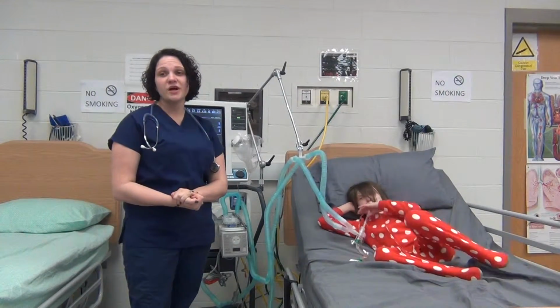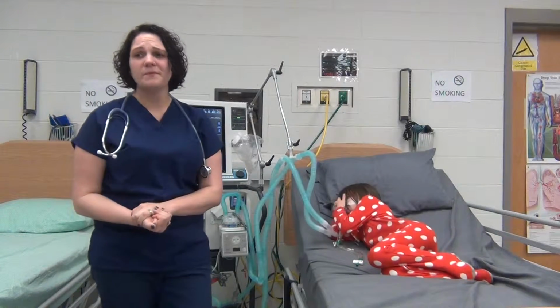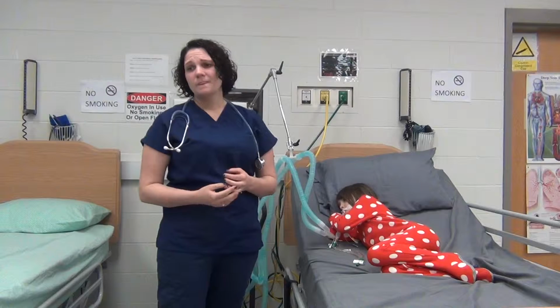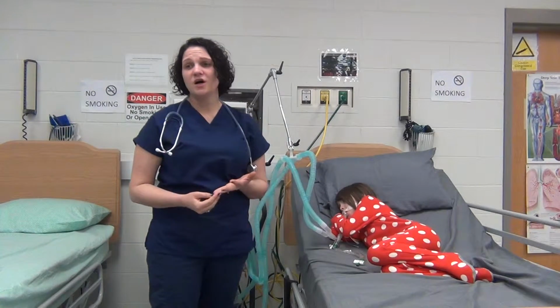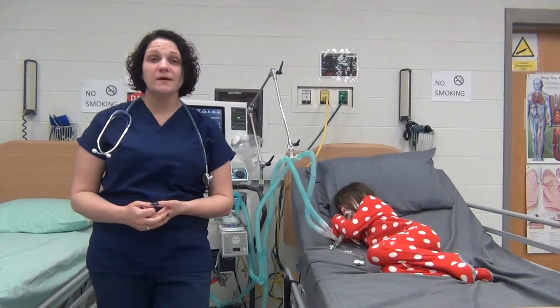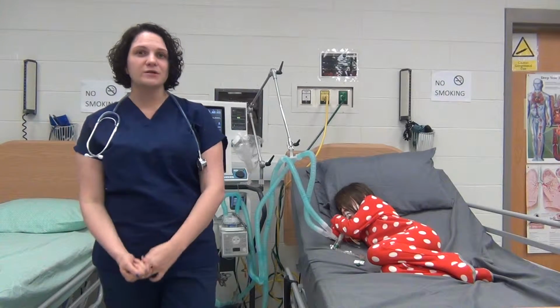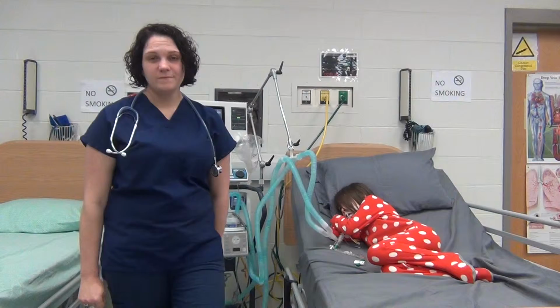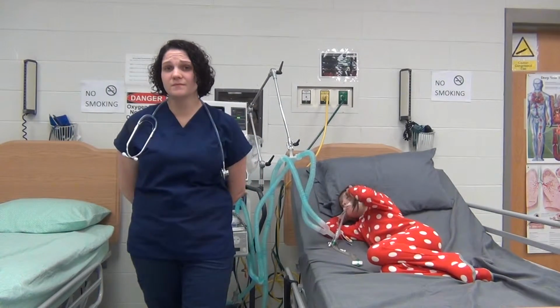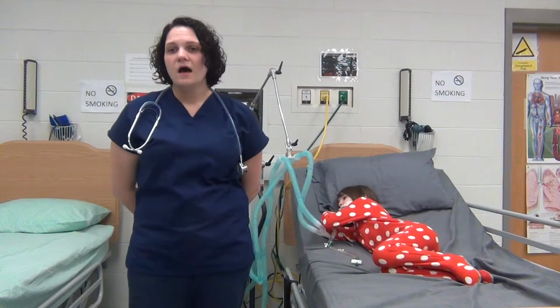I would manage her FiO2, pressure support, and PEEP by leaving them on their current settings because you can wean a patient off of the vent on an FiO2 of 35% and a pressure support and PEEP of 5 centimeters of water pressure. Those are good settings to wean off of.